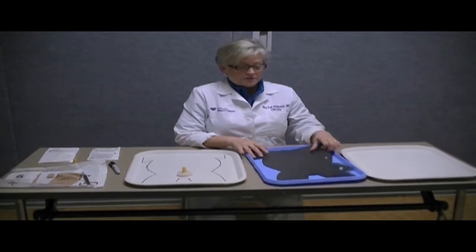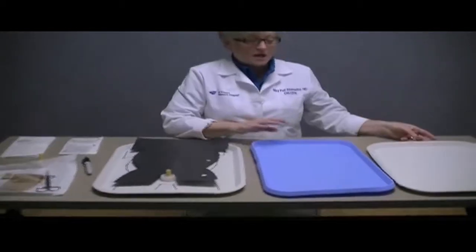To tell you how we made a very inexpensive, low fidelity circumcision model. And this is mostly used to train the new interns when they come in for their intern boot camp at our institution. So first of all, we started with any type of a tray.